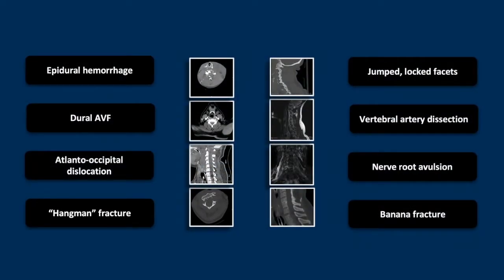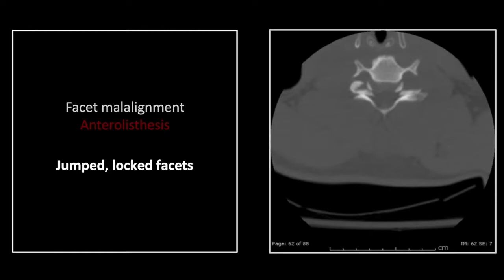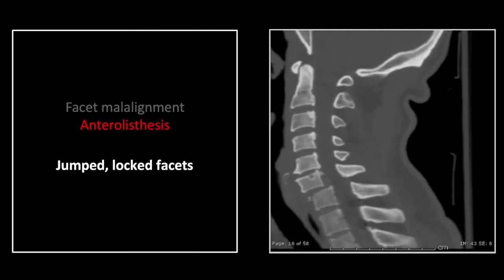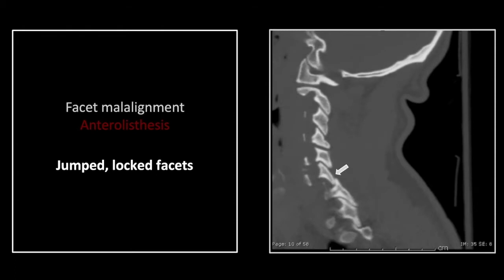Our next case is jumped-locked facets. You can see the reversal of the facet joints — upside down or inverted hamburgers. On the sagittal, this is best appreciated. You can see there is complete jumping and locking of the facets with the expected anterolysthesis of the C6 vertebral body. On the opposite side, it is frequently a bilateral phenomenon with jumping and locking of the facets.